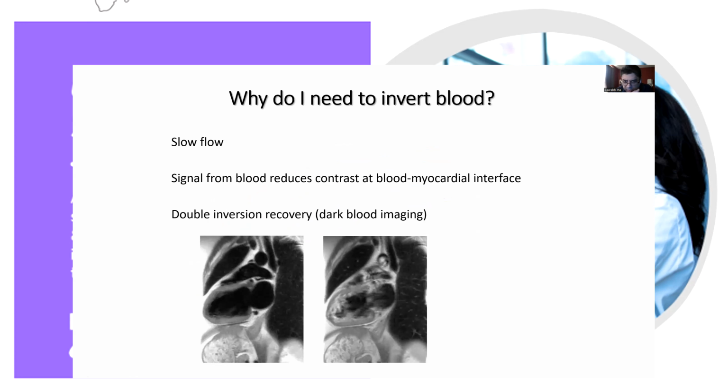One of the things about the angiographic contrast and the voidness of blood on traditional spin echo is that you have in-plane movement of blood. You have blood moving through structures that are not orthogonal, and slow-moving. You can see the difference between these two.